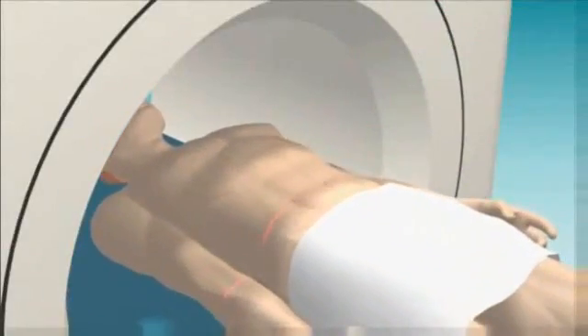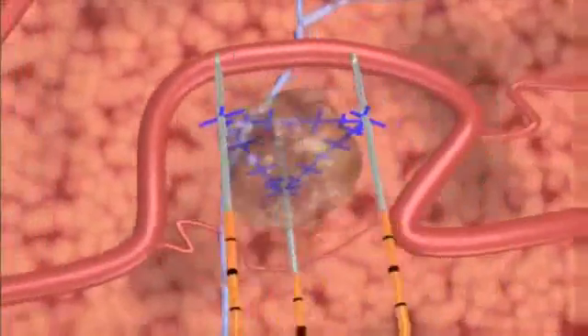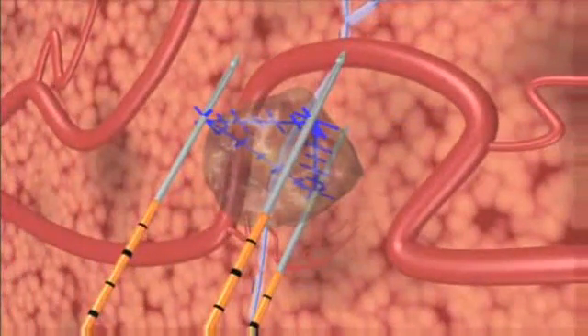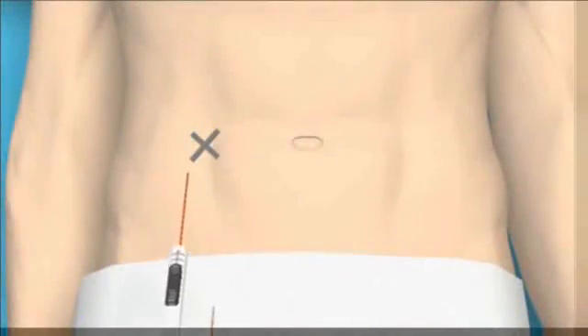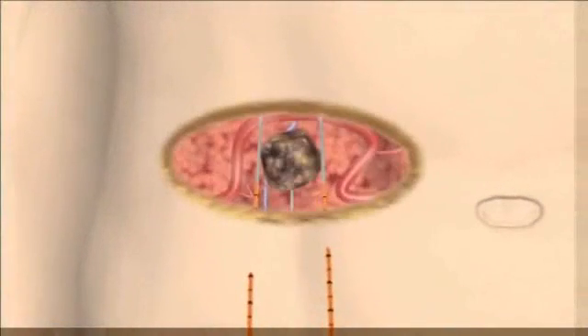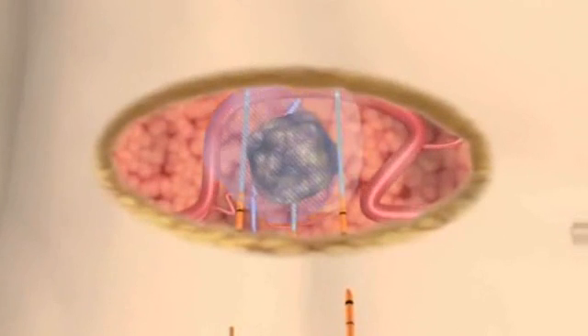Preoperative imaging allows precise calculation of the tissue volume and shape to be treated and aids the planning of appropriate positioning for the NanoKnife IRE electrodes. A NanoKnife IRE treatment consists of a series of 90 extremely short electrical pulses, each less than 100 millionths of a second. Cell death is induced within seconds, and the patient can often be released from the hospital the same day.